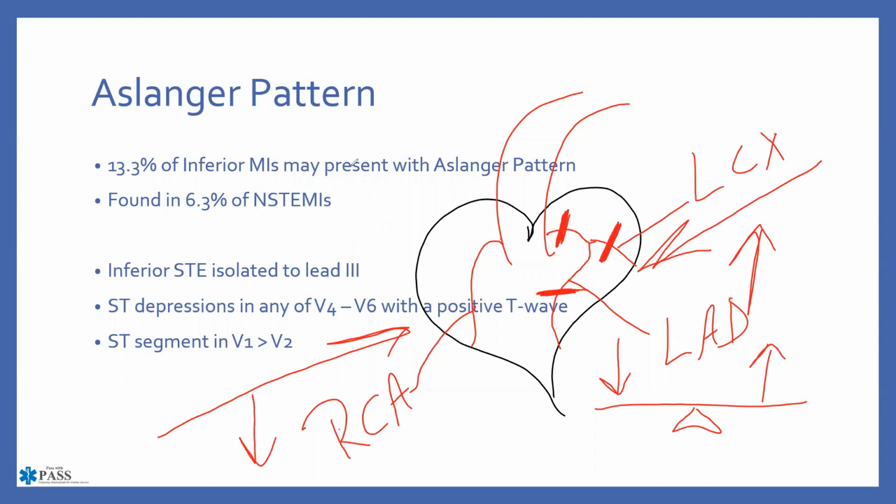So why is this important? What I want you to think about is this. You do an EKG today, and it is showing you that you have an infarction or a STEMI pattern in your anterior leads. Is there any reason to move leads over? You guys can answer that question. Unmute or put it in chat. You find anything in your anterior wall, are you going to move leads over, or are you just going to call in and say, hey, I've got an anterior wall infarct?